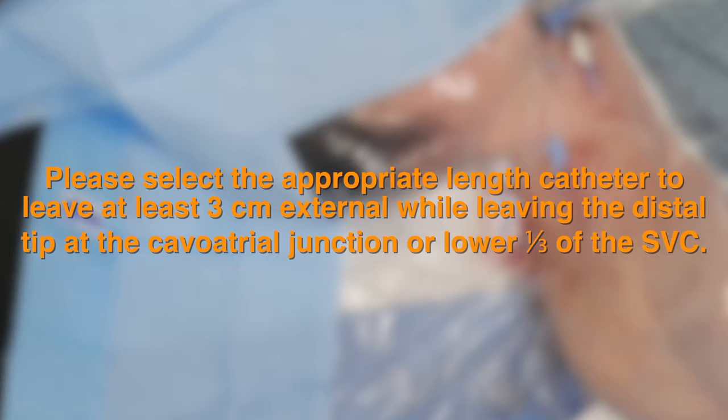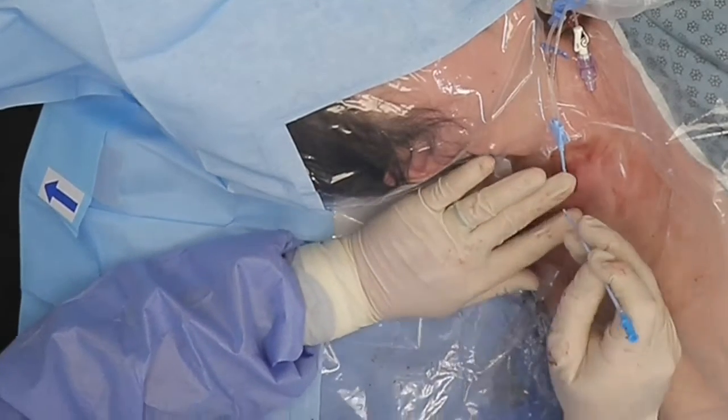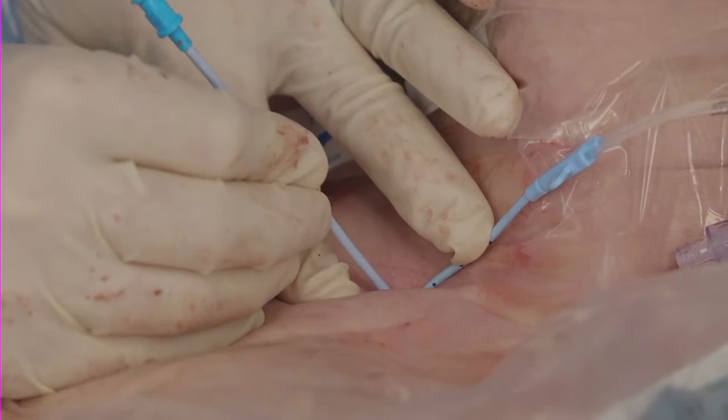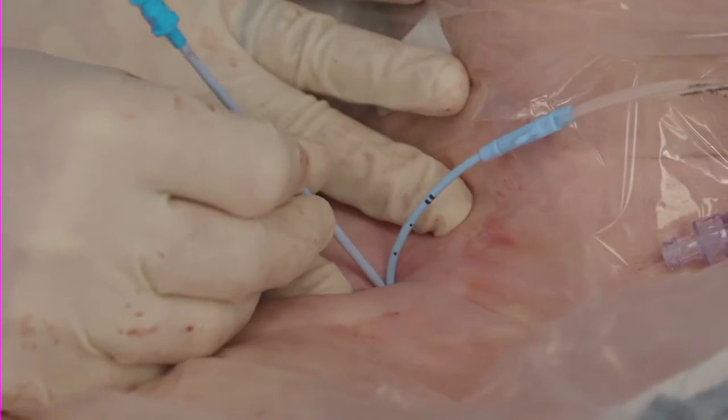While leaving the distal tip at the cavo-atrial junction or lower one-third of the SVC, lift the catheter to visualize the insertion site. Use the tip of a dilator to temporarily dilate the skin opening if necessary to allow easier insertion.